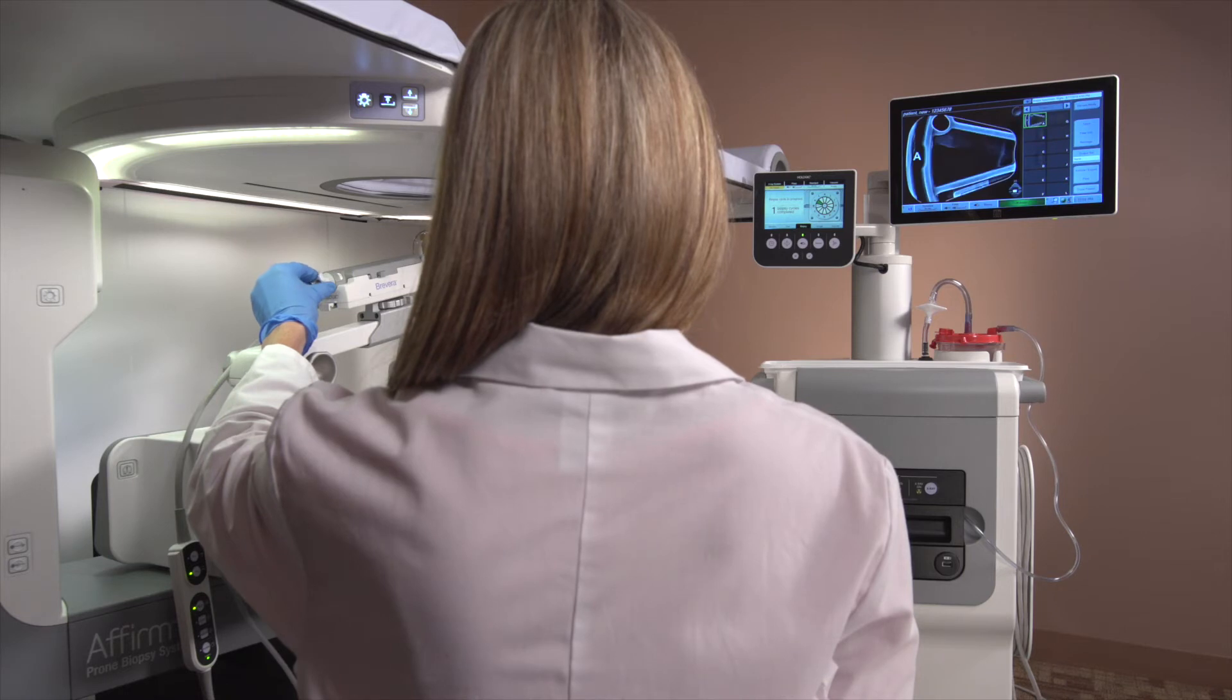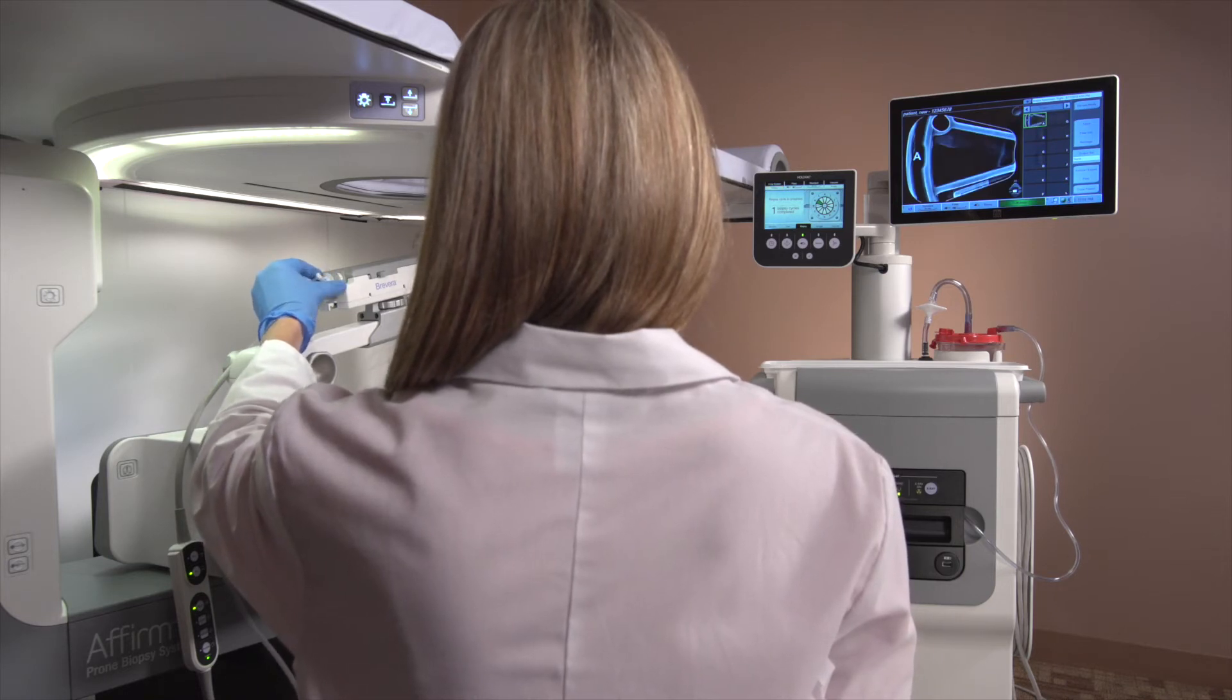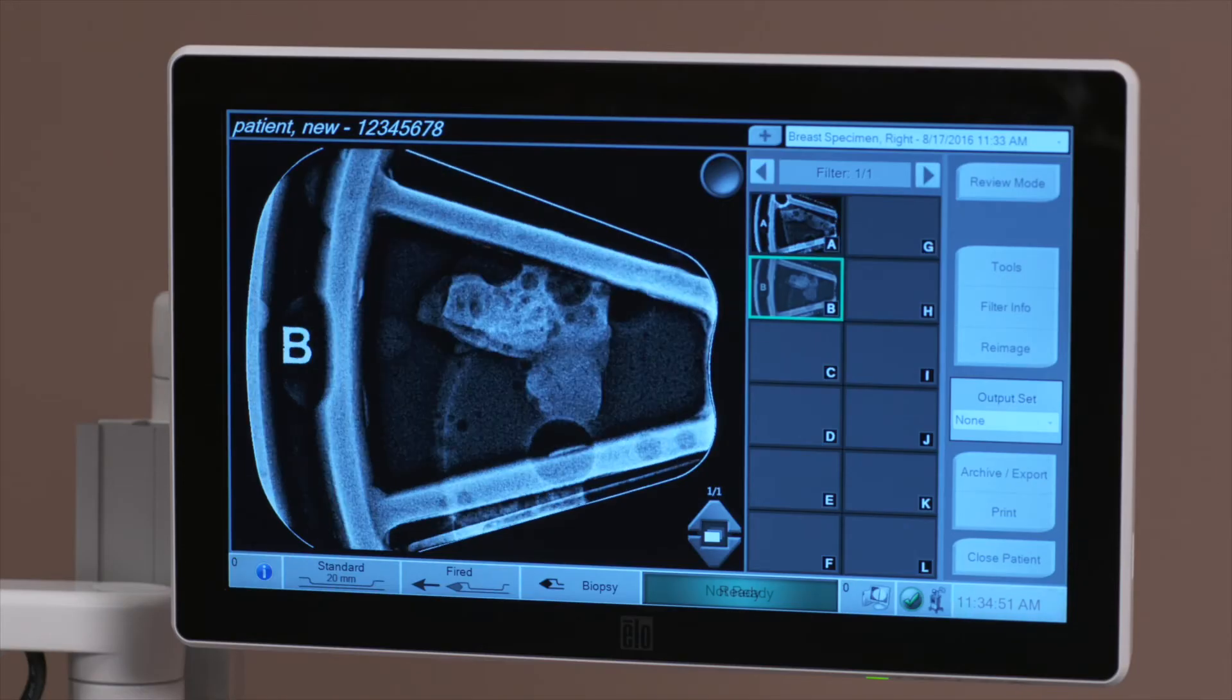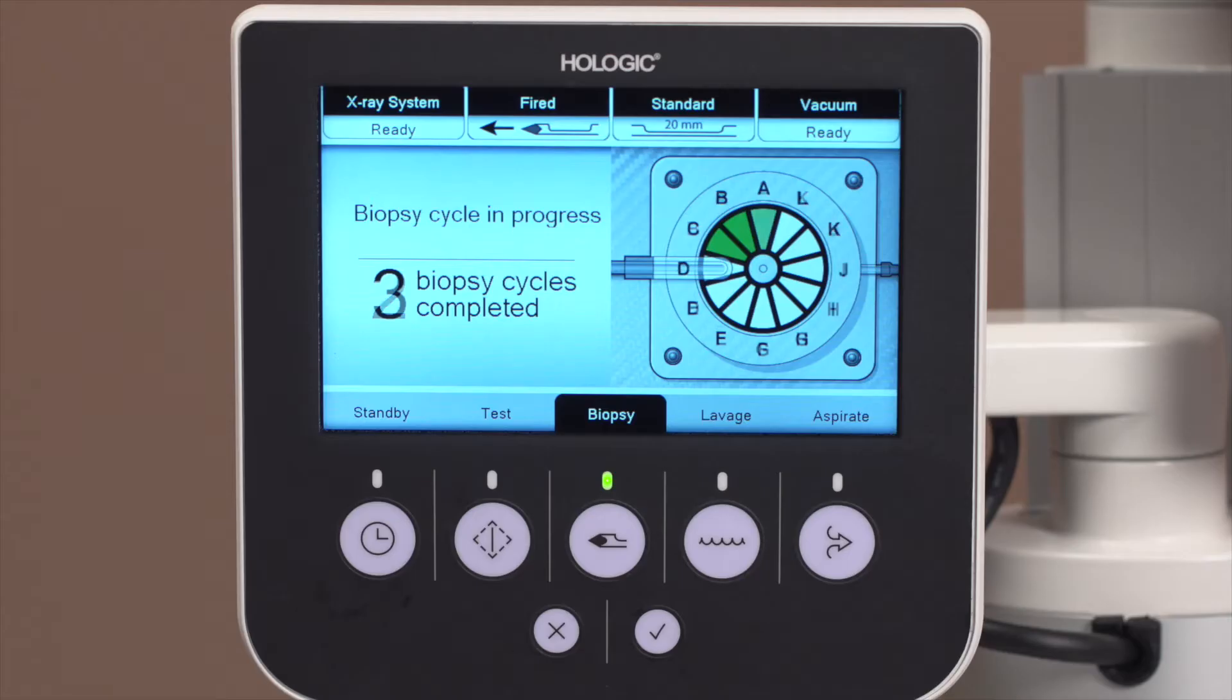The image of each sample will update on the imaging display as each X-ray is processed. Each image will contain the corresponding letter designation labeled A through L for each tissue filter chamber imaged. The technologist display will state how many biopsy cycles have been completed and will depict an image of the filter wheel indicating which chambers have been filled with a specimen highlighted in green.